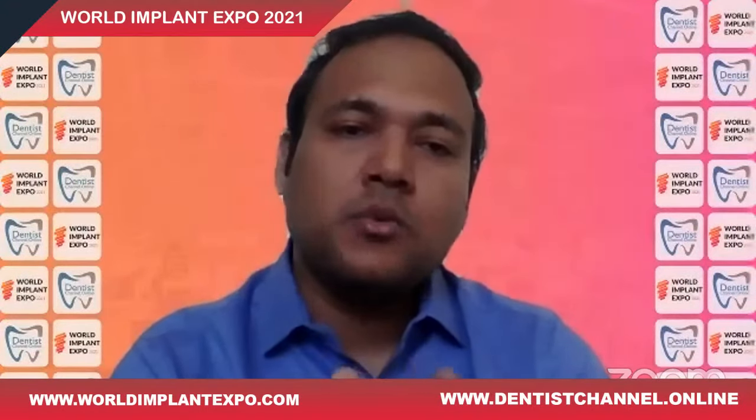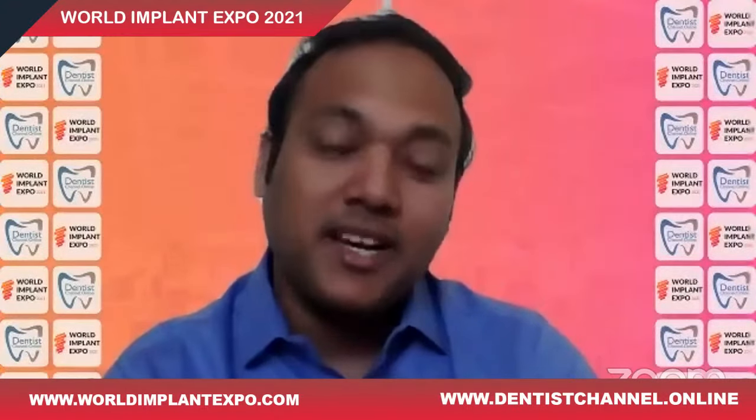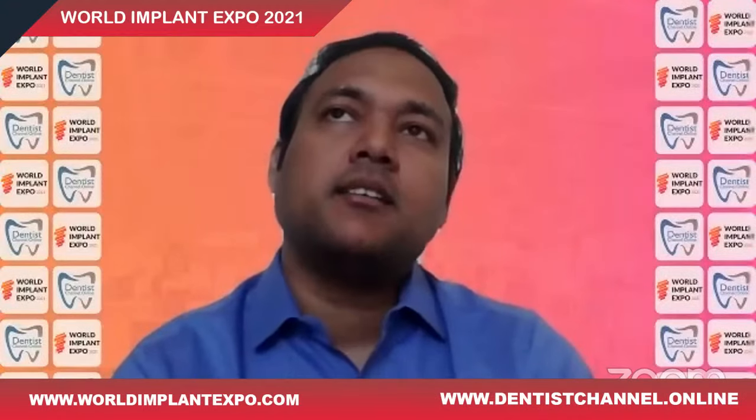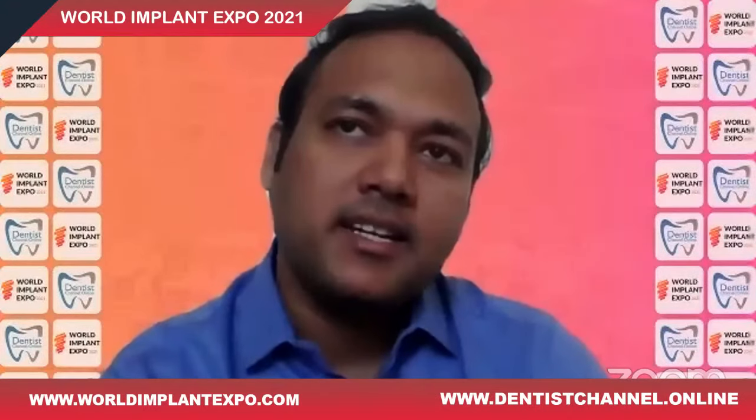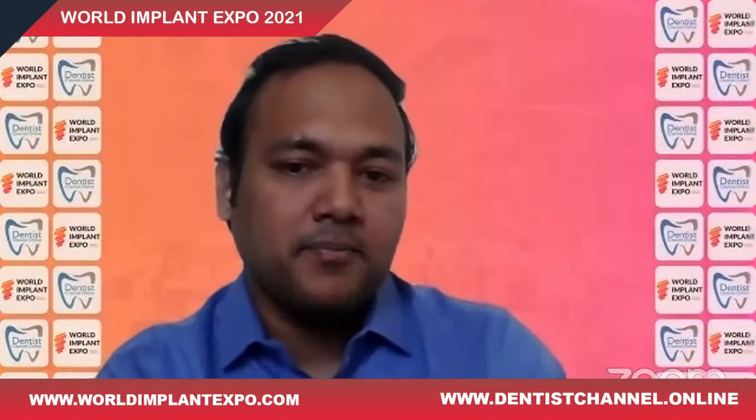I guess the question is aimed at depicting the density of the bone. When we talk about bone densities, a CBCT is going to give us a hazy figure of what type of bone it is. Cortical bone is D1 bone, right? So the image that we get is going to be highly radio-opaque or less radio-opaque.